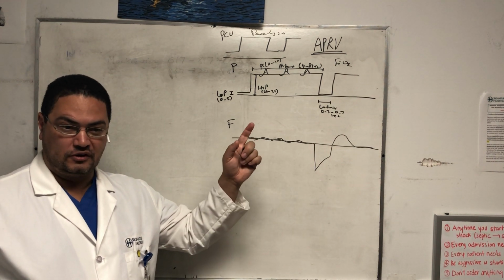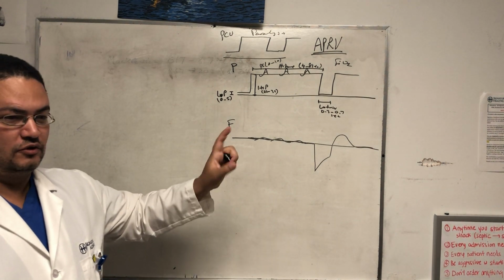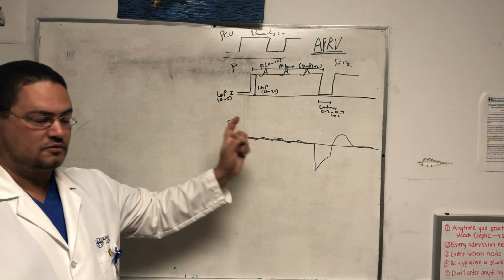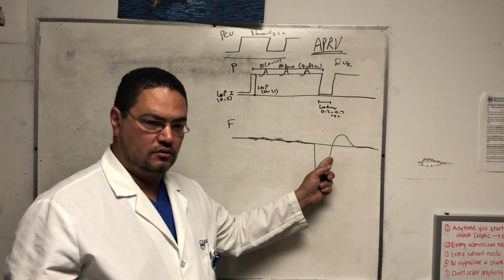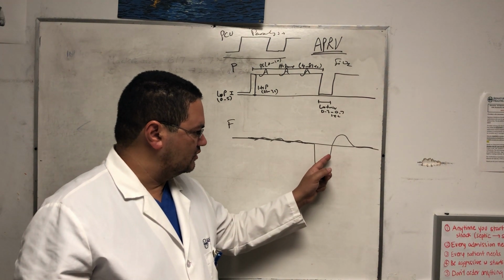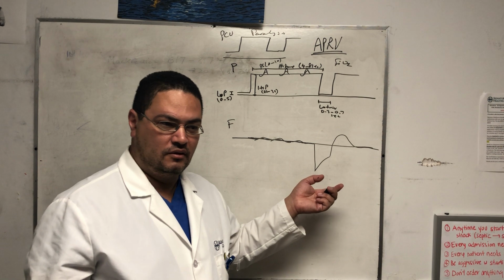The terms are very important, especially in this. You can kill patients if you change the terms. This is not called the machine breath, it's called the release breath, and this is called the spontaneous breath. Okay, what do we call this in other modes of ventilation? If you have a mode of ventilation that has exhalation, it goes like this, and it doesn't finish, we call that the auto peep, right?